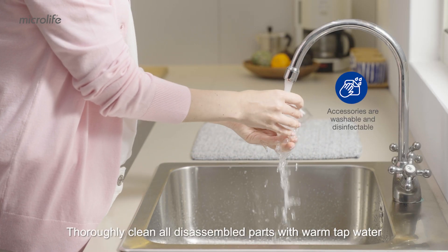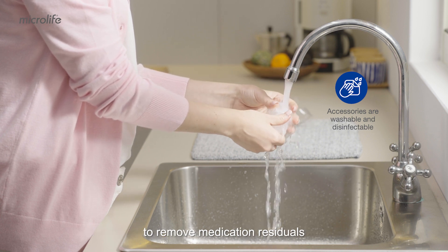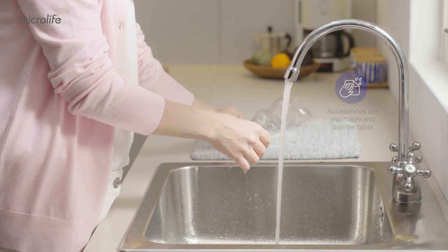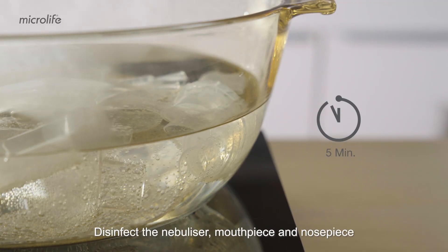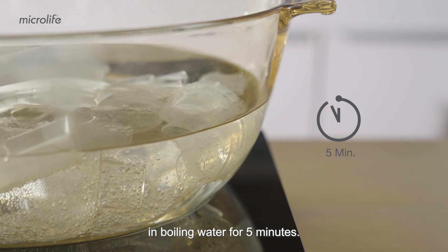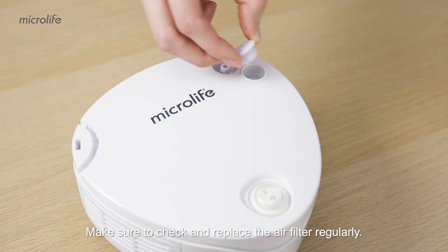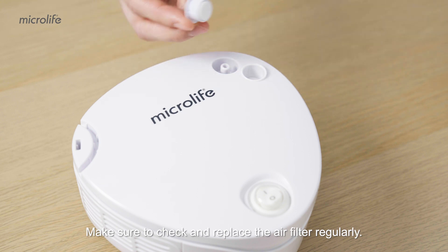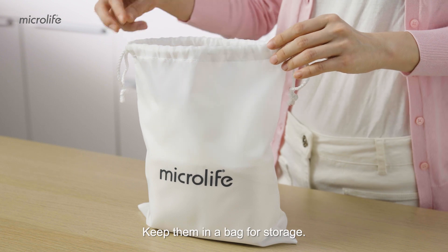Thoroughly clean all disassembled parts with warm tap water to remove medication residuals and impurities after each use. Disinfect the nebulizer, mouthpiece, and nose piece in boiling water for five minutes. Let all parts air dry. Make sure to check and replace the air filter regularly. Keep them in a bag for storage.